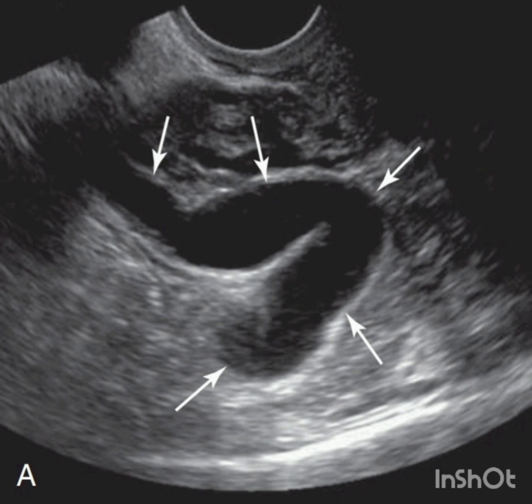Most common etiology of hydrosalpinx is pelvic inflammatory disease or PID. The other etiologies include ectopic pregnancy, endometriosis, tubal ligation, and pelvic adhesions. On ultrasound, hydrosalpinx appears as a fluid-filled dilated adnexal structure with a tubal configuration.